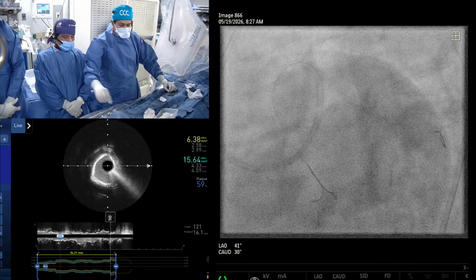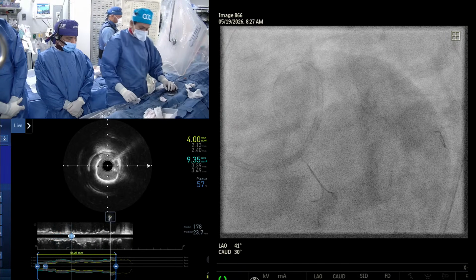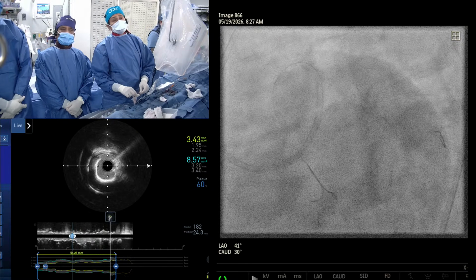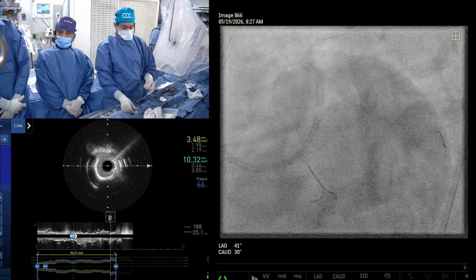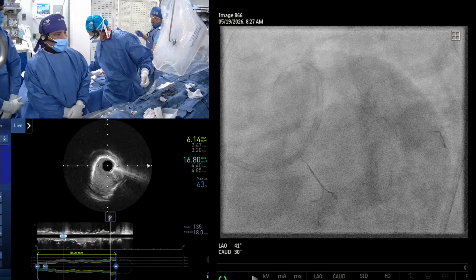Good. You don't see fracture when you do rotational atherectomy. Yes, correct. You need something extra, a different mechanism to be done. Now, shave the calcium. Yes. So looking at this, I think we should do an IVL. Good. Now take the rotor wire out. You have 3 wires now. So we have put a wire into the circumflex.